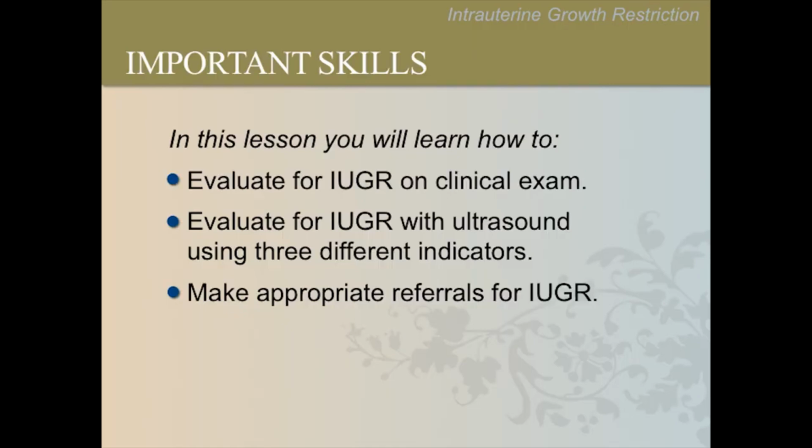Main skills you will learn in this lesson. You will learn how to evaluate for intrauterine growth restriction, or IUGR, on clinical exam, evaluate for IUGR with ultrasound using 3 different indicators, and make appropriate referrals for IUGR.